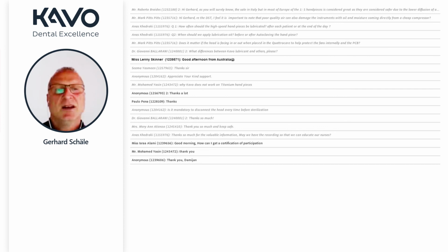That's the important point. The background behind it, as I said, is that we want to make sure that no particles stay inside the instrument when you place it into the sterilizer. If you do not sterilize the instrument because you clearly say, okay, this is a semi-critical B instrument, I do not have to sterilize it, you still have to spray it at least twice a day. If you do it more often, no problem, it works, of course. Yeah, more often is not wrong.